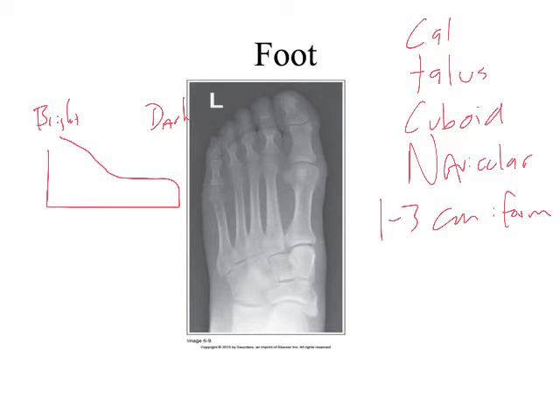So if you ever talk about inherent or added filtration, like what we were talking about earlier, this is one case where we may add additional compensating filtration, right? And the compensating filter for this piece of anatomy would look, let me see, kind of like this, right? We would want the remnant beam to receive more filtration on, wait, I've got it backwards, don't I?